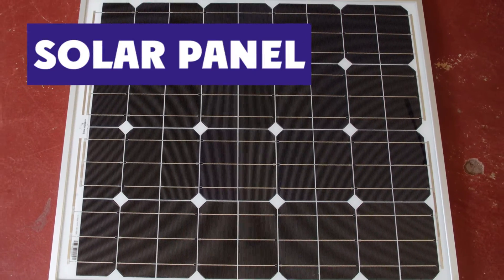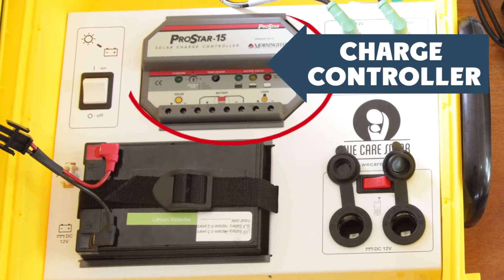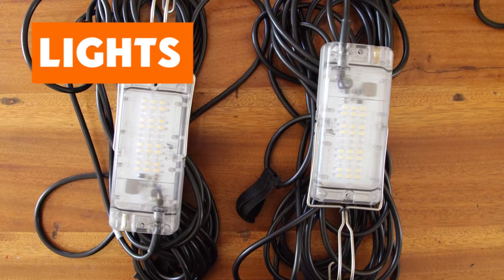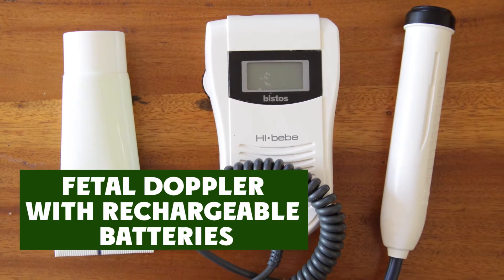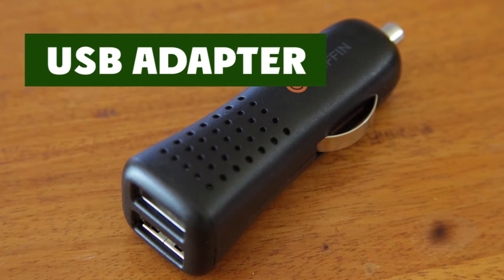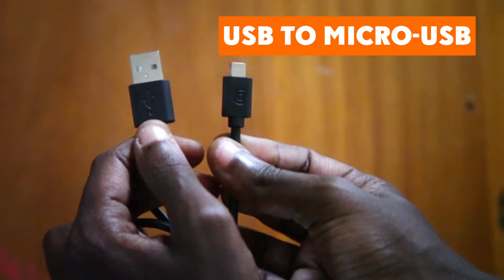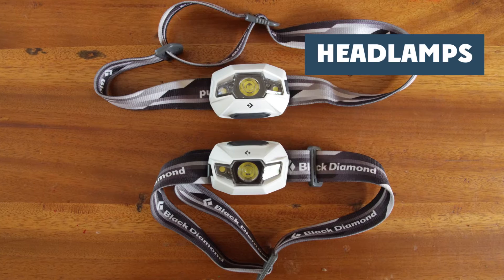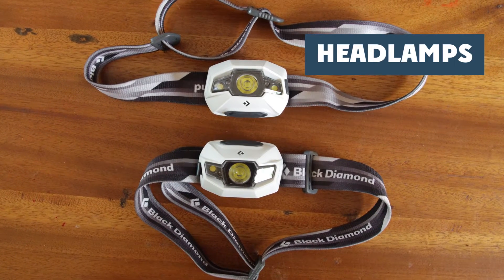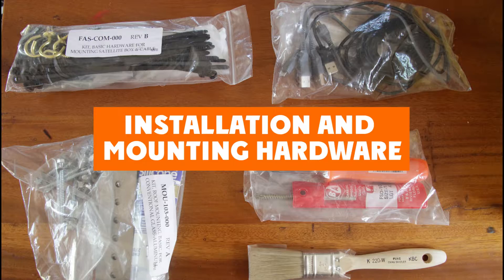It includes a solar panel, home run cable, main control board, battery, charge controller, and light appliances. Also included are a feto-Doppler with rechargeable batteries, a USB adapter, a USB to micro-USB wire, a multi-tip USB phone charger, two headlamps or torches with rechargeable batteries, a battery charger, and installation and mounting hardware.